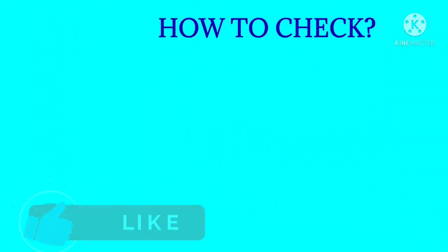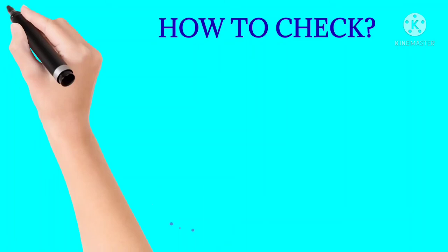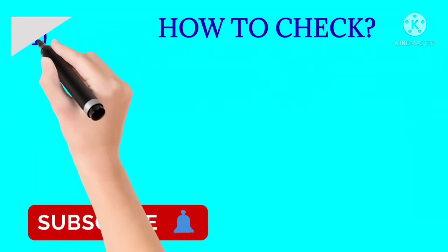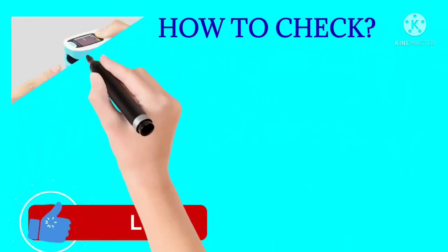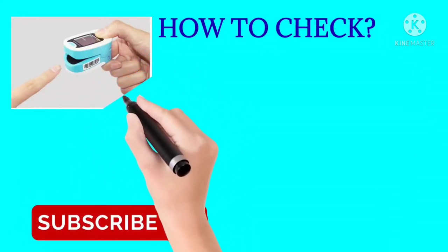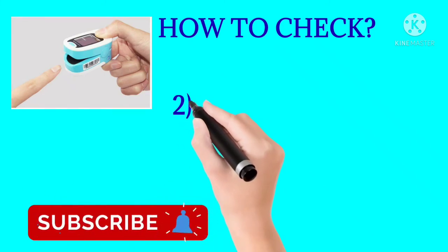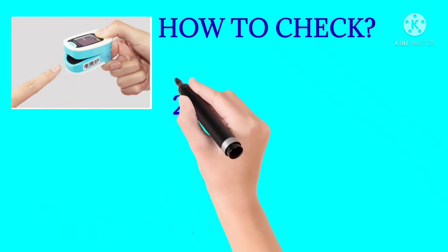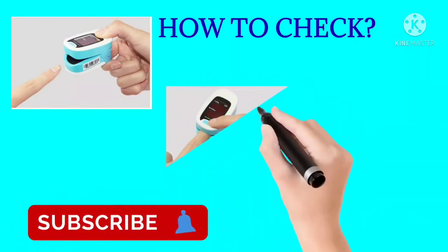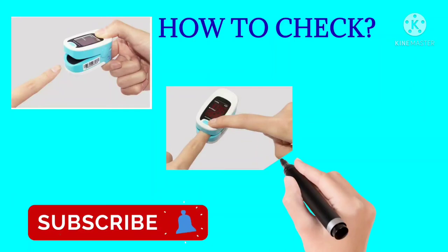How to check: The first step is to remove moisture using dry cotton. Ensure the finger is dry and free of water before use. Insert the finger into the pulse oximeter clip.